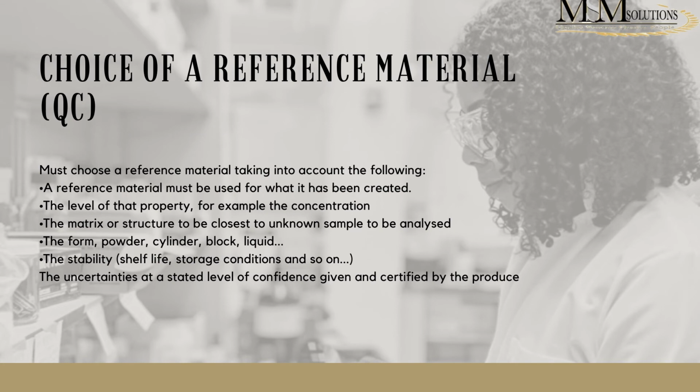There are times where you find that people will be using a QC material and not necessarily having looked at how do I actually choose a QC material? What are the things that you need to take into account? Let's just discuss some of those. Firstly, when you look at a QC material, you need to first understand, what do you need this for? What are you creating this material for?